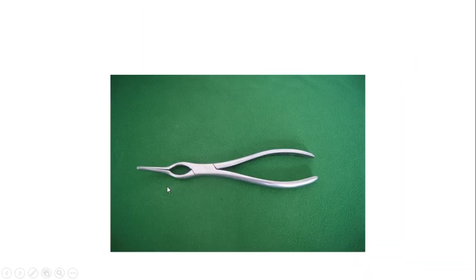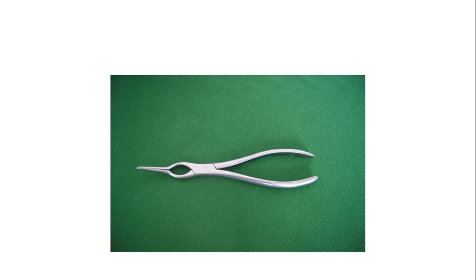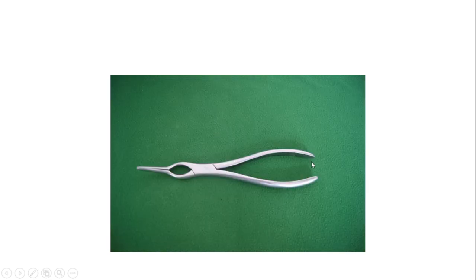This is the kidney tray. Next is the Ash forceps, which should be differentiated from the Walsham forceps. If you look at the Ash forceps, the two tips are bent and do not close completely. The Ash forceps is used to reduce fractures of the nasal septum. For the Walsham forceps, if you remove the rubber covering, the two ends close completely — one end is straight and goes inside the nasal cavity, and the other is bent toward the skin, so it does not damage the skin. It is used to reduce fractures of the nasal bone.